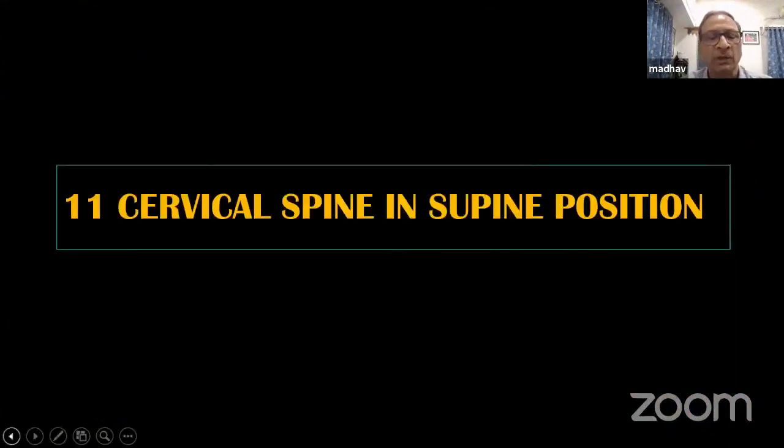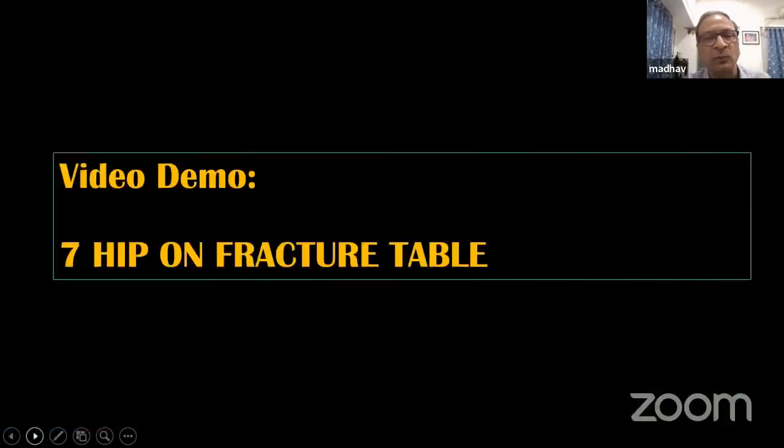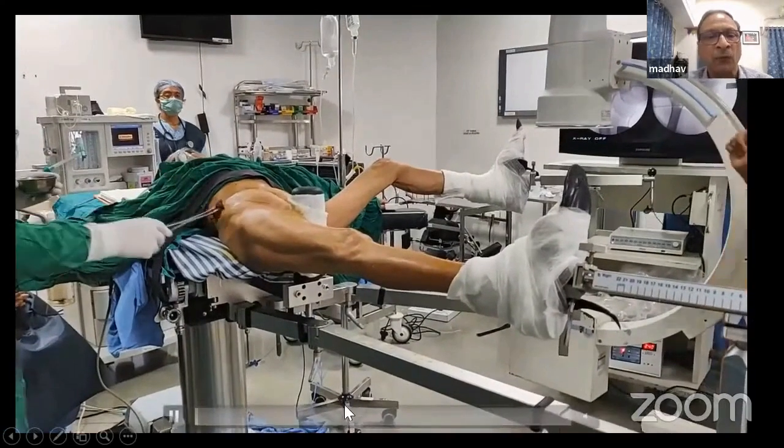This one is a very important sheet — a big sheet at the upper part, which goes right from the chest wall all the way to the floor.